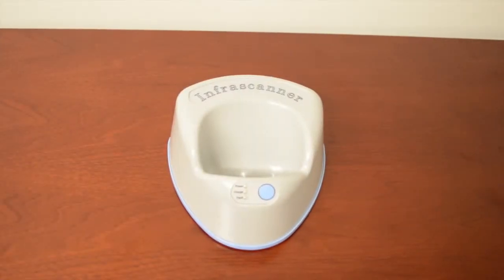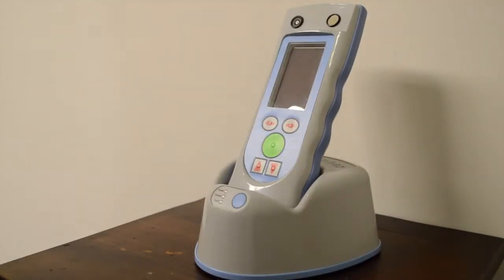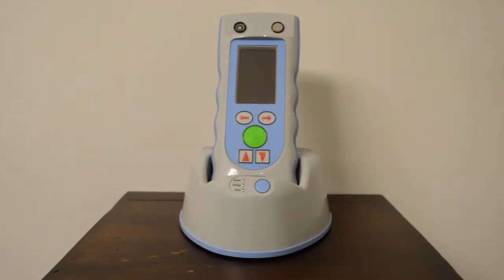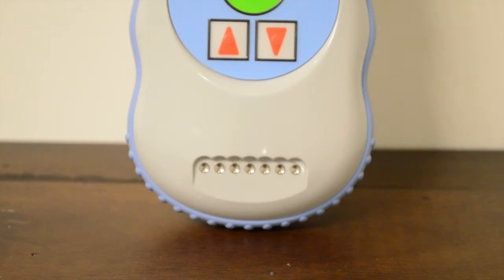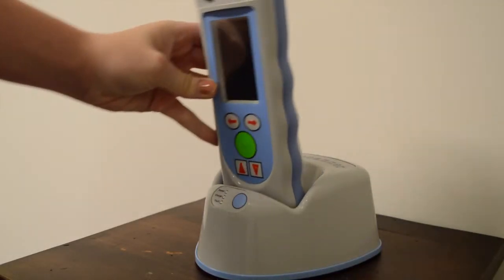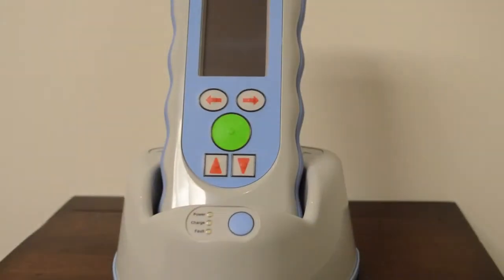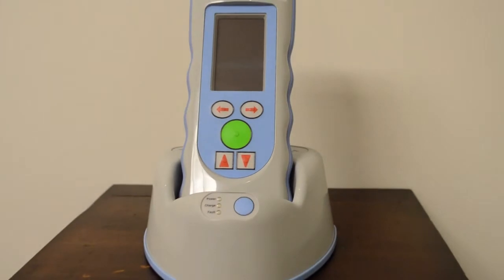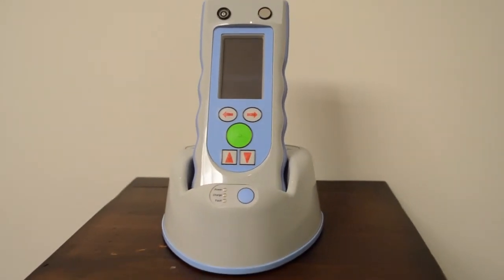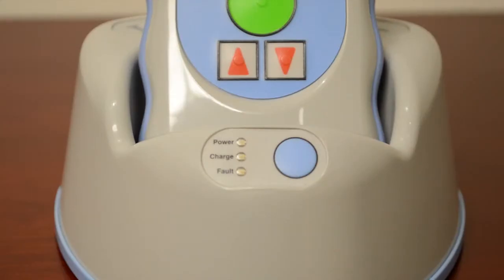When placing the InfraScanner in the cradle to recharge, insert it vertically and then lean it backwards, making sure to line up the spring-loaded cradle pins. To remove, tilt the InfraScanner forward and lift up vertically. The InfraScanner will run for 90 minutes, taking approximately 15 scans on the rechargeable battery pack. It takes approximately six hours to fully recharge the battery.